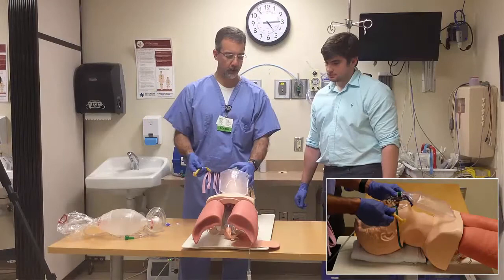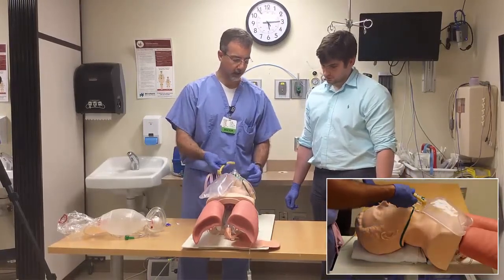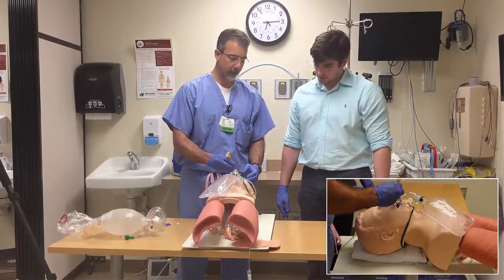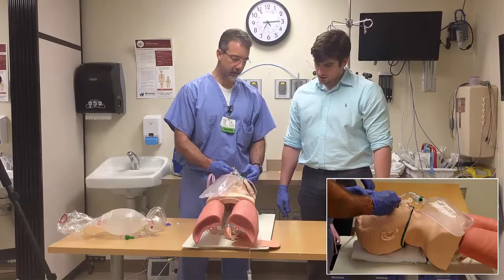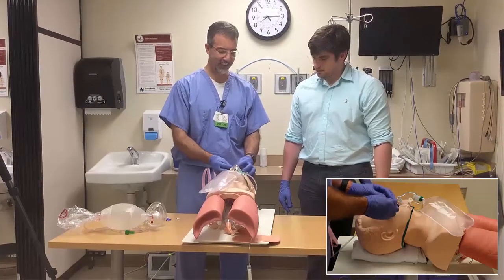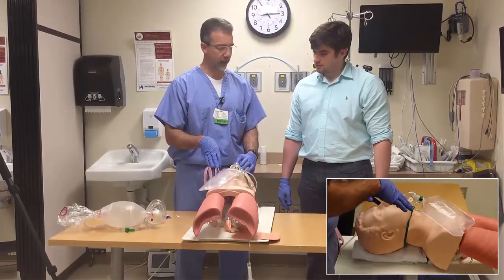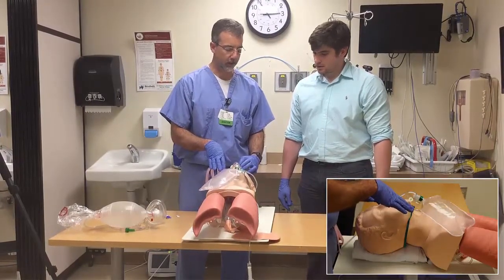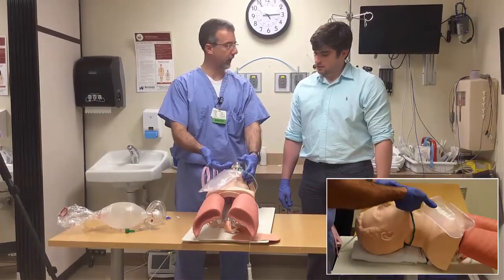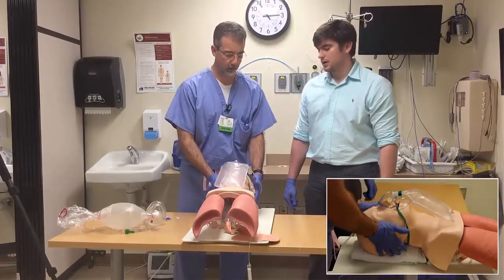Remove his mask down below his nose. Remember the anatomy — you want to go straight back. It will slide nice and easily. You can see why it's called a nasal trumpet. This goes all the way down around the hard and soft palate into his pharynx and can provide a route for oxygen to make its way down into his airway.